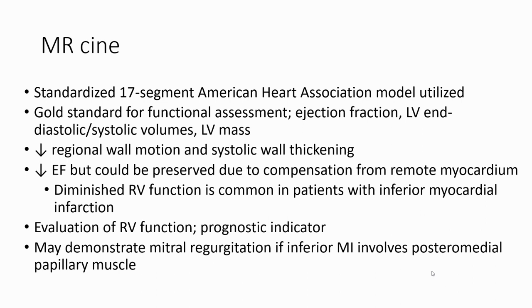Evaluation of right ventricle function is a prognostic indicator. Cine may demonstrate mitral valve regurgitation if inferior myocardial infarction involves the posterior papillary muscle.